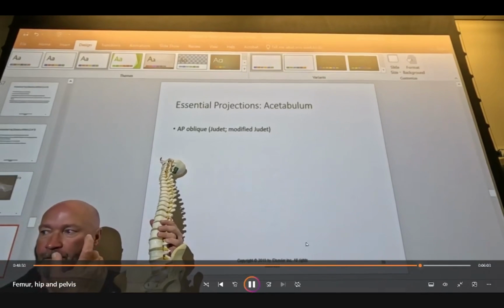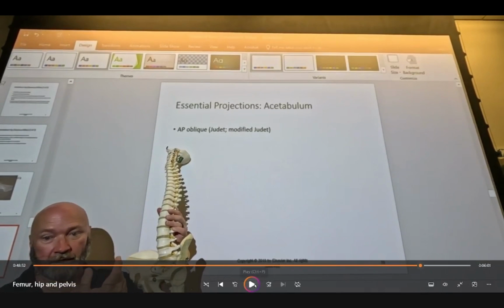So pause this a minute and look back at the image that you're seeing on page 400. What you get in that LPO then is the open anterior pelvic bones for a frontal view of the anterior pelvic bones. You also get an open acetabulum for a frontal view of the acetabulum. You get a lateral of that right iliac wing. On the left-hand side, what you get is a lateral of the acetabulum. You get a lateral of the anterior pelvic bone, and you get more of a frontal view of the iliac wing. Now you reverse all that for the RPO.